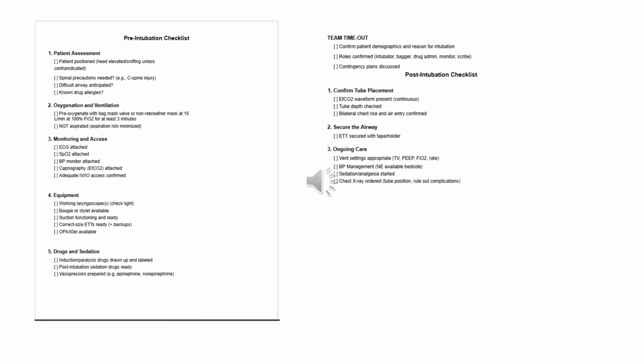This is what the checklist looks like. It has a pre- and post-intubation section. The checklist will be located in the airway boxes with the respiratory therapists. Let's briefly walk through each section and discuss why each step is important.